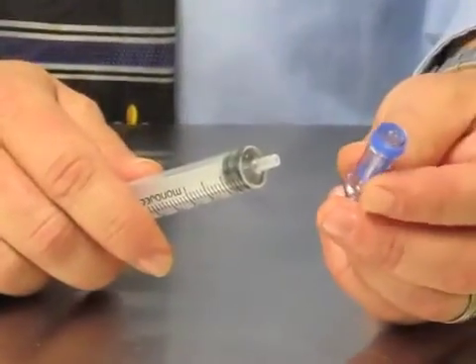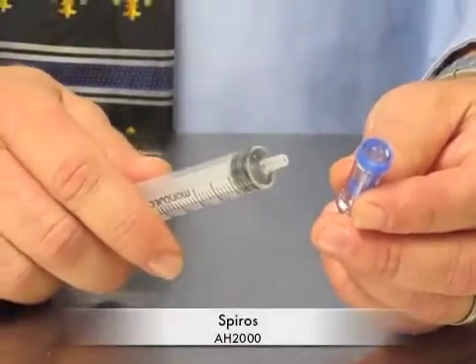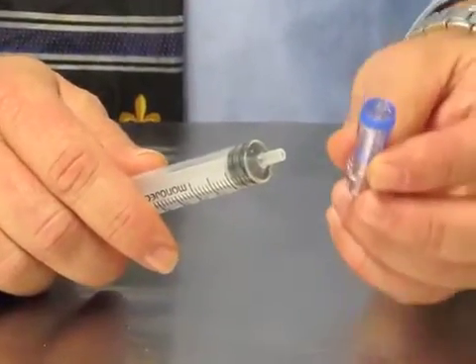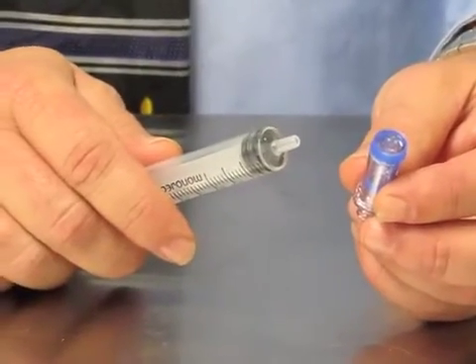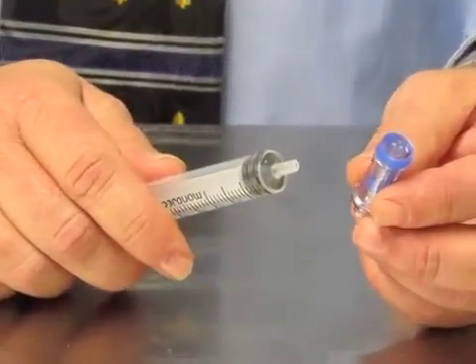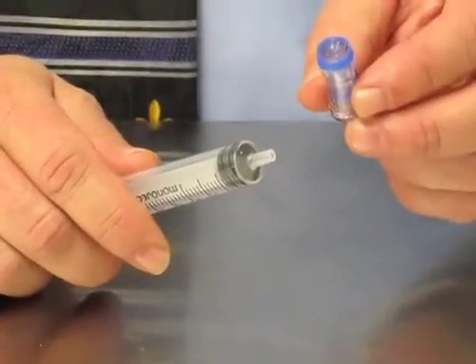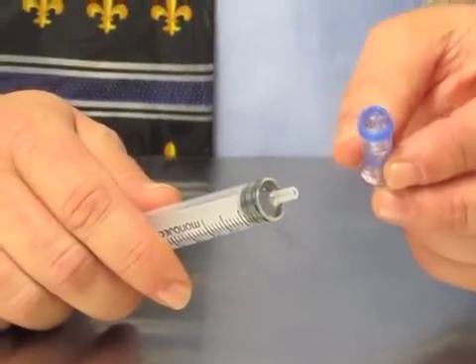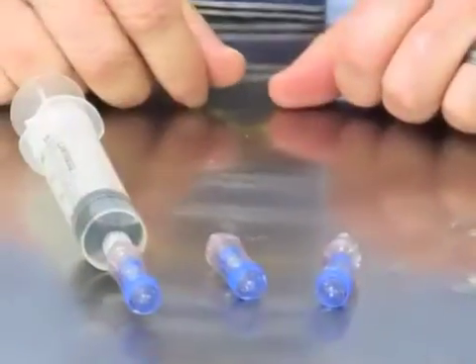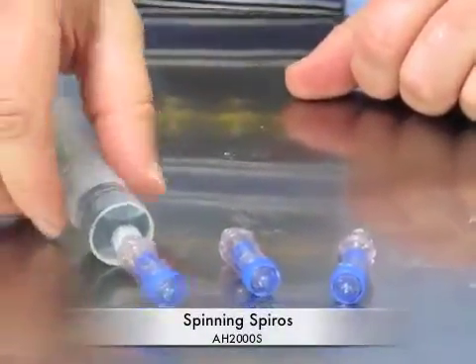The Spiros is a closed system compliant with USP-797, OSHA, and NIOSH. The Spiros attaches to the syringe or end of an IV line to keep the clinician from being exposed to hazardous drugs. The Spiros remains closed until lured to any female lure, such as a needle or a needle-free device like the microclave. The Spiros is available in two different versions.